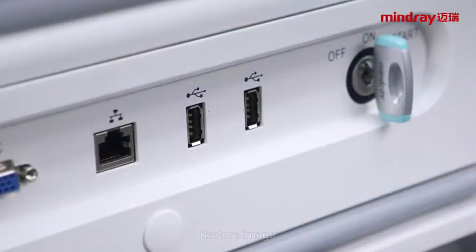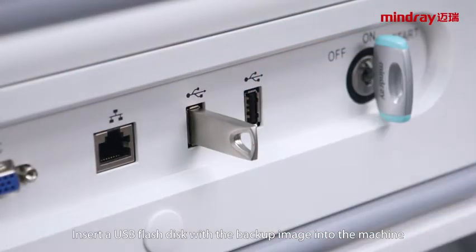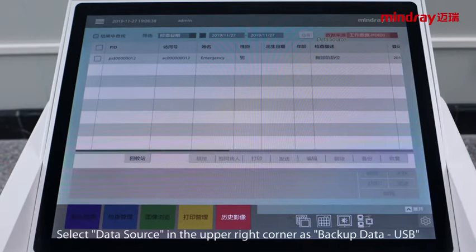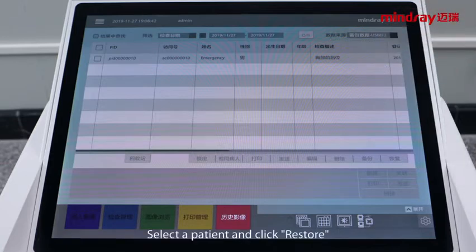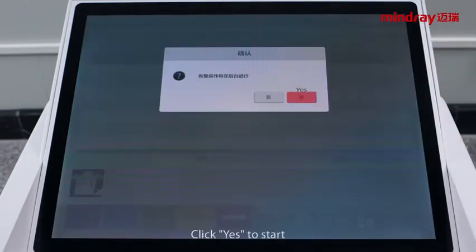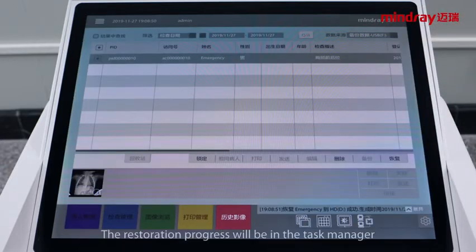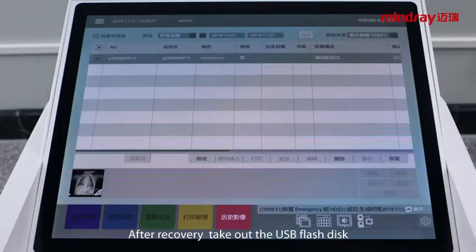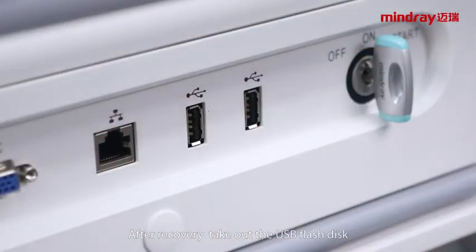To restore images, insert a USB flash disk containing the backup image into the machine. Click history. Select the data source in the upper right corner as backup data. Select a patient and click restore. Click yes to start. The restoration progress will be shown in the task manager. After recovery is complete, take out the USB flash disk.